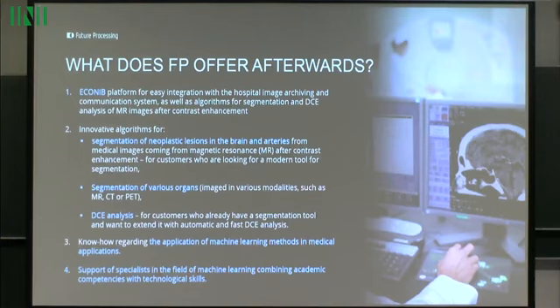What is also important to remember is that we are trying to develop the application, but if we are trying to build a good architecture, we may divide the entire application into modules. So we may have a good segmentation, which might be easy to change in the future. We may have good modeling of the contrast flow, which also might be changed in the future, and I think that should be the way to go, to have a good pipeline with some parts that might be easily changed if necessary.